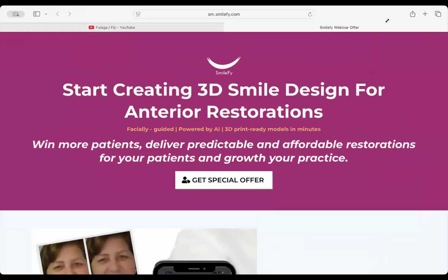So our dentists are very, very focused on aesthetics, of course, and you can do composite restorations really chairside, and you can have a lot of cases with the composite restorations because it's a very easy procedure. If it's an additive case, even quicker. You have the control over the design, and you can do a lot of stuff chairside.